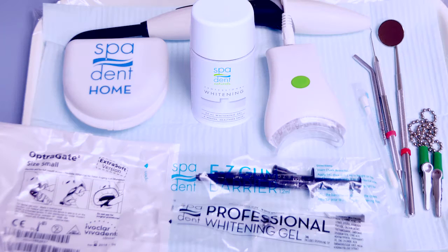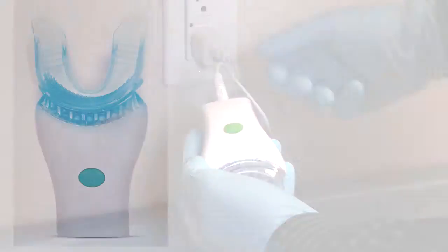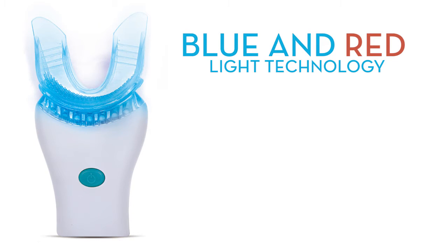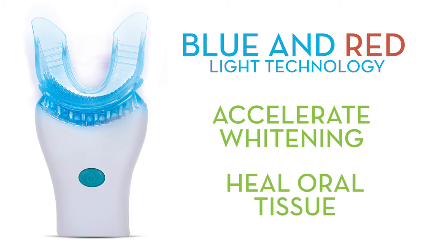After the treatment, your patient can take the tray, case, and pump home to continue whitening with SpaDent home gel. Prior to starting the treatment, ensure your rechargeable whitening pod is fully charged. It's designed with blue and red light technology to accelerate whitening and heal oral tissue while minimizing any contraindications.